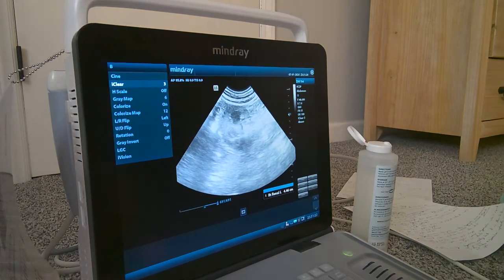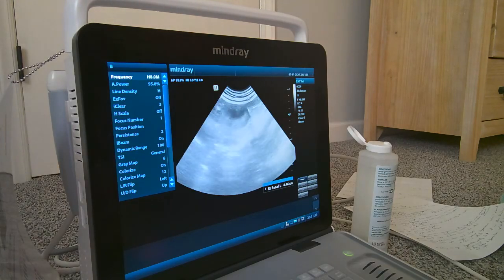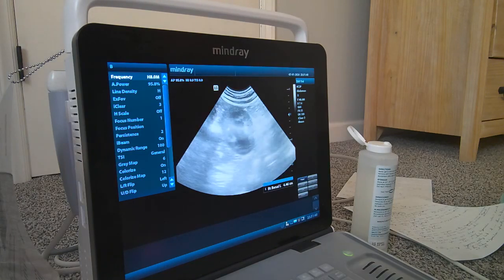It's almost this small little area right here that we're looking at. If I was measuring that, it's really small, right about 2 millimeters or so is the distance on there, which is normal. If you start getting fluid therapy, a lot of times you'll start seeing them a little bit higher, maybe 3 to 4 millimeters or something. If I start getting more than 3 to 4 millimeters, that's really making me concerned.